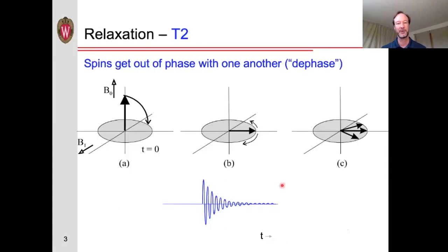And the source of that T2 contrast was that, as you recall, we have the magnetization vector aligned with the main magnetic field. And then we send in a radio wave along this axis here, and it creates a force and tips that magnetization vector perpendicular to the applied radio wave. And so it flips it around that axis. And if we apply the RF pulse just long enough to flip it into the transverse plane, we call that a 90-degree pulse. And then because of the interaction between the spins, they experience slightly different magnetic fields, and that causes these spins to dephase. And as a result, over time, the signal decreases.